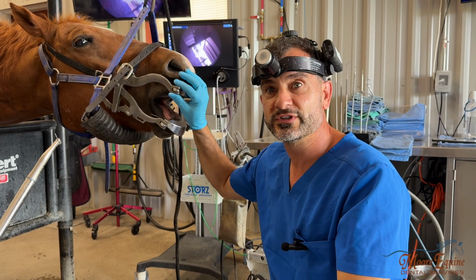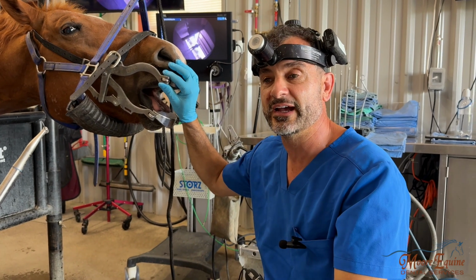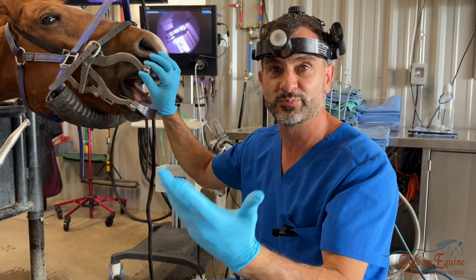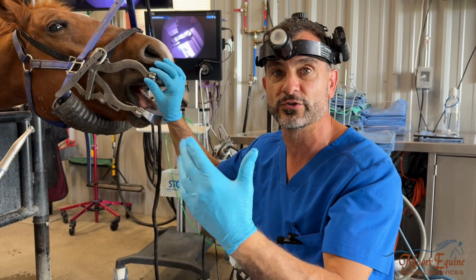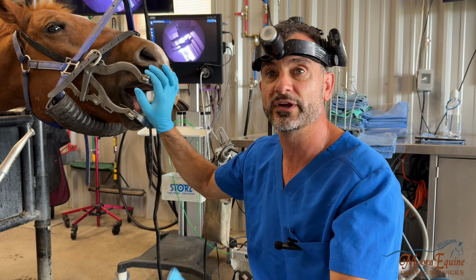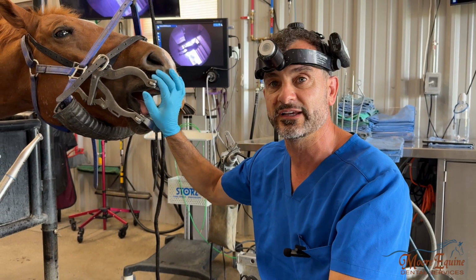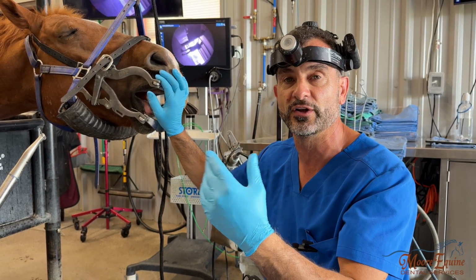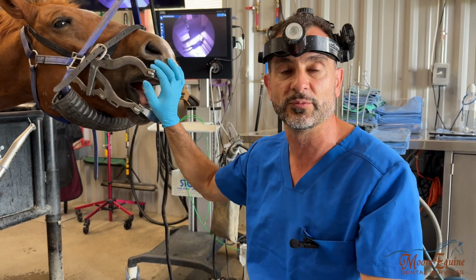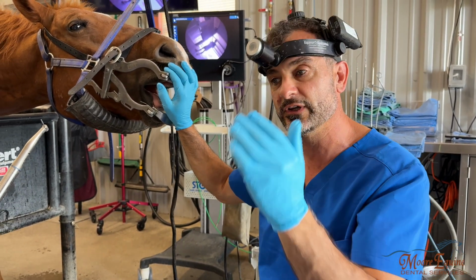Okay, so we've got a horse here. We'll show you in the mouth that has some developmental issues that can lead to fracturing. A lot of times people always have the question of why do their horse's teeth break? Sometimes we don't always know, but other times there's certain pathologies like infundibular caries that are due to development. Many times, in fact, probably a lot of the pathology we see is developmental in origin. But we'll show you here what it looks like.